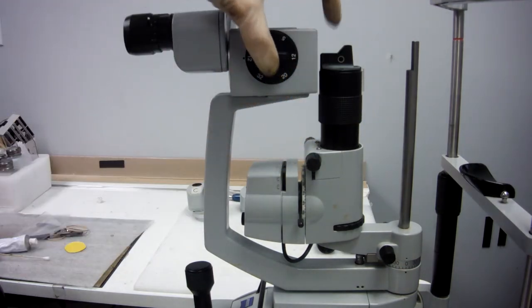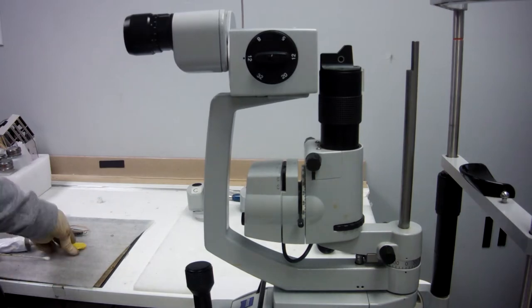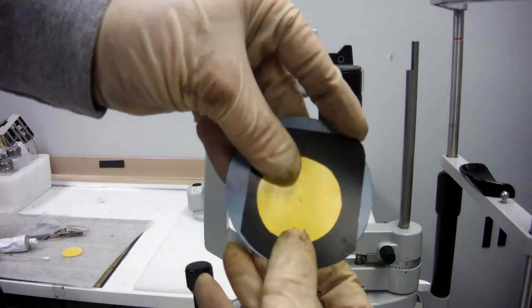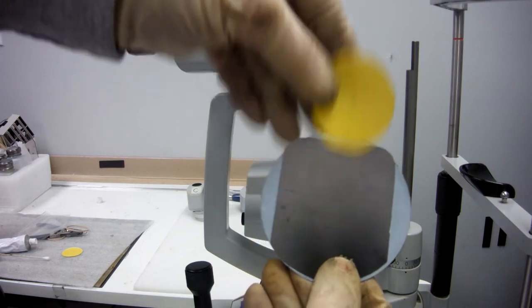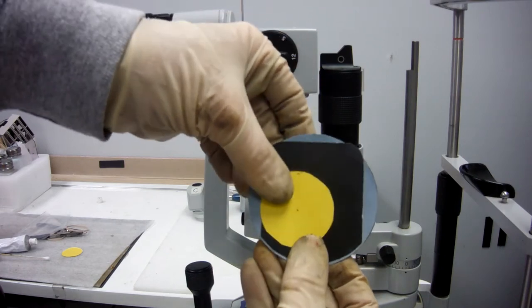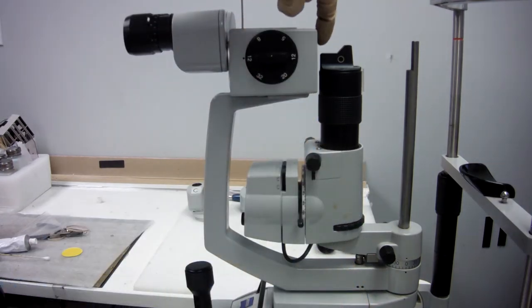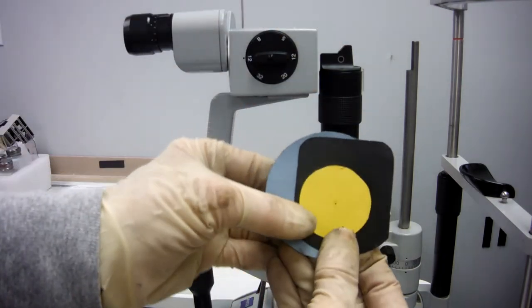Now, once you have it aligned and you look through your binoculars and the light is not centered on your bar, if it's to the left or down, even though your space on each side is good, your light might be off. And so, to adjust up and down, right here on this prism, the back of this prism, there's a little screw. And that would make it go up and down.